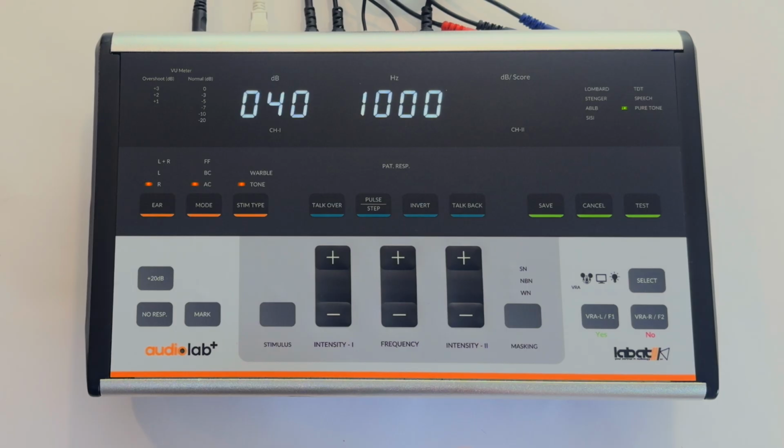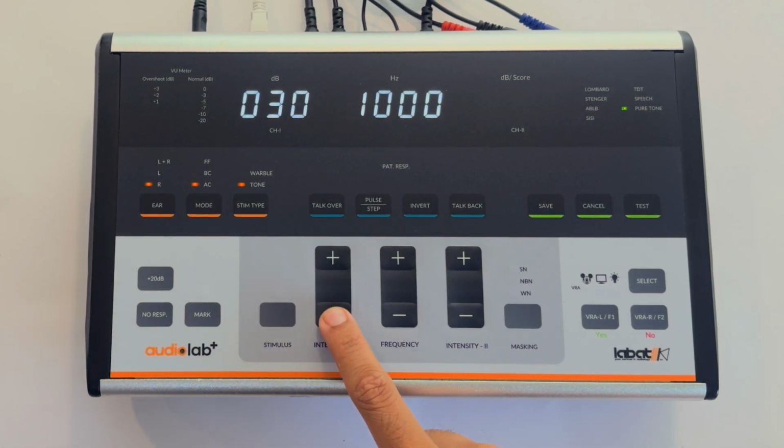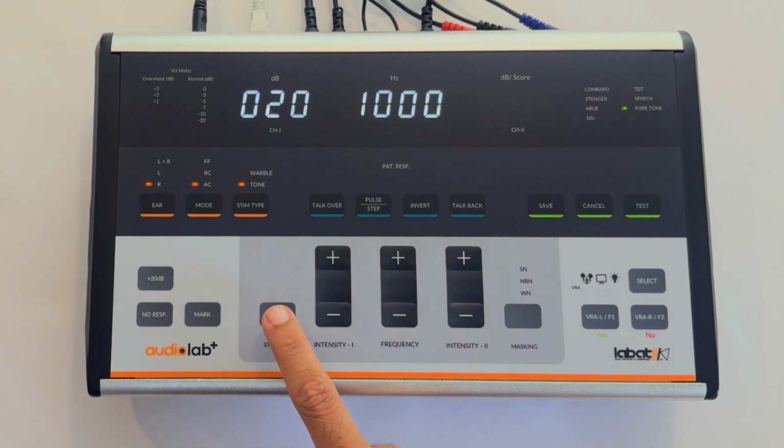Begin with air conduction test for the right ear at 1000 Hz and present the stimulus. If the patient responds, decrease intensity by 10 decibels and present again. Continue until there is no response. When there is no response from patient, increase intensity by 5 decibels and present the stimulus again. Once the patient responds, confirm it and mark the threshold by pressing Mark key. The marked intensity will blink once to confirm that the marked threshold has been registered.